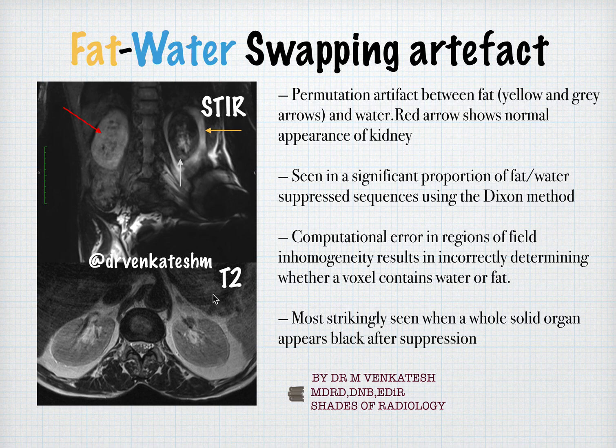The same patient's axial T2-weighted image shows normal signal intensity of both kidneys. So what is this artifact? This is called the fat water swapping artifact. This is a permutation artifact between fat and water, seen significantly in fat water suppressed sequences using the Dixon method. It is a computational error in regions of field inhomogeneity — when there is an inhomogeneous magnetic field, it results in incorrectly determining whether a voxel contains water or fat.